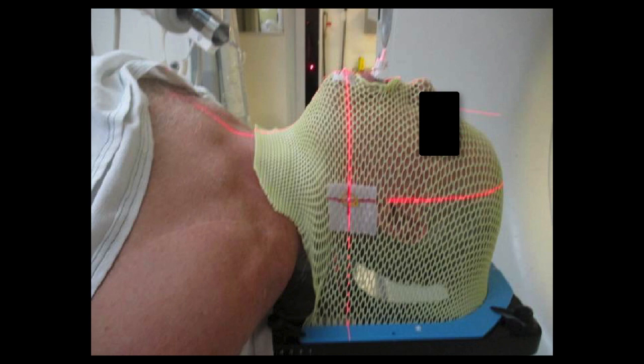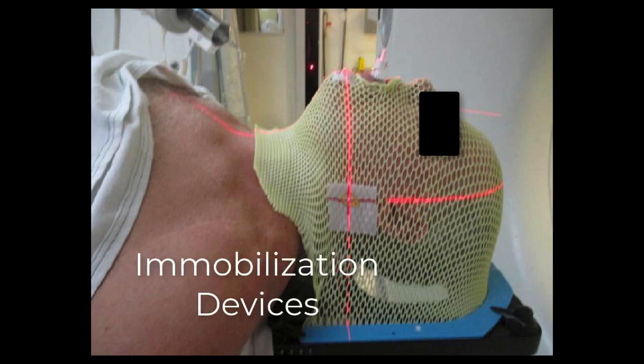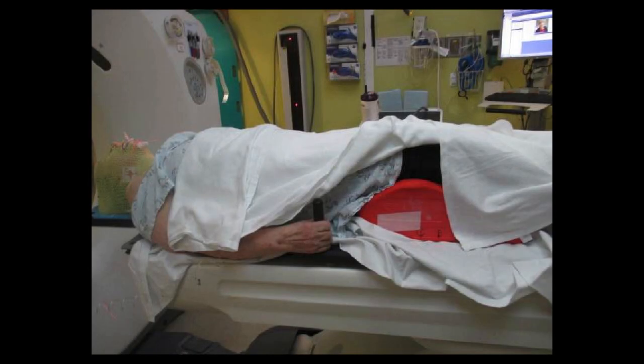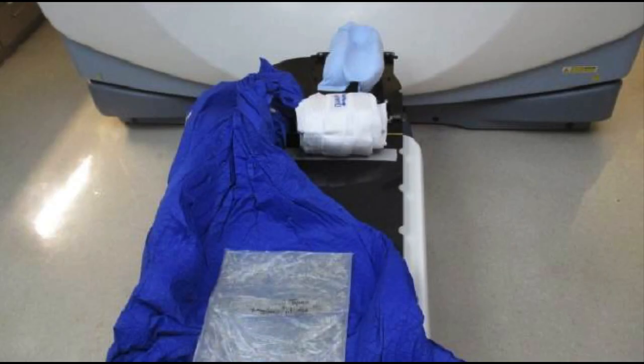This is accomplished with the help of a variety of types of devices. The goal here is not to keep the patient completely immobile, but to make a reproducible setup that's comfortable for the patient. A lot of different devices are used here, and they can be simple. For example, this leg roll under the patient's legs, always at the same position every day. The hand holder at the side of the couch so the patient's arm is in the same position every day. There are, for example, moldable head holders that can go under the patient's head. There are these vacuum sealable bags that mold to the patient underneath to get the same exact shape of the body contour.